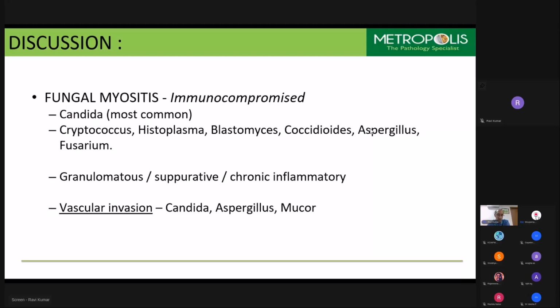As in this case, it is because of vascular invasion. Did you look for vascular invasion, Dr. Maporna? Yes, sir. Did you find it or not? Sir, it was not present in the case. It was not present. Yes, good. So it was not present.